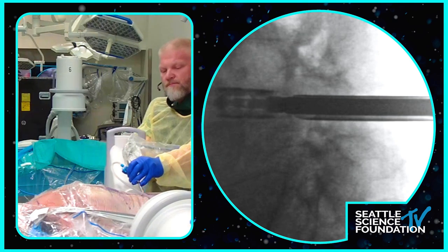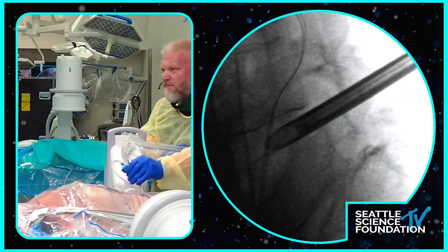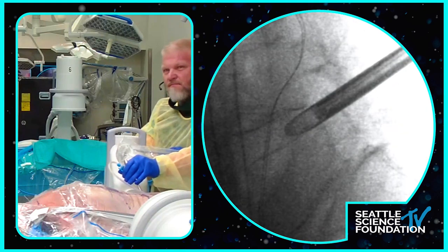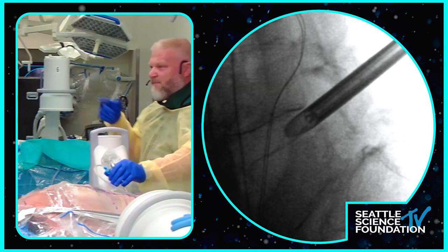Can't do it from back here. Okay, can you just take one more lateral x-ray just to show where we are? Okay. See, I'm in the disc there, back up here, shot. So, right there in the disc. All right. And then back to AP.